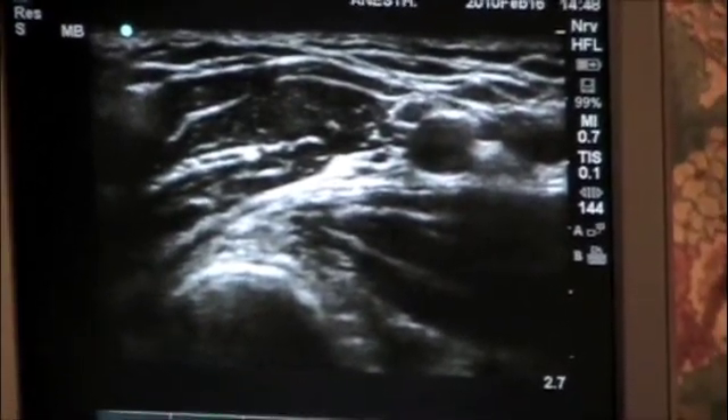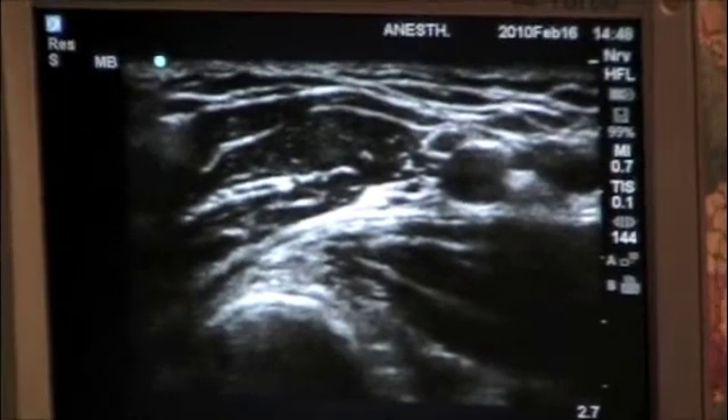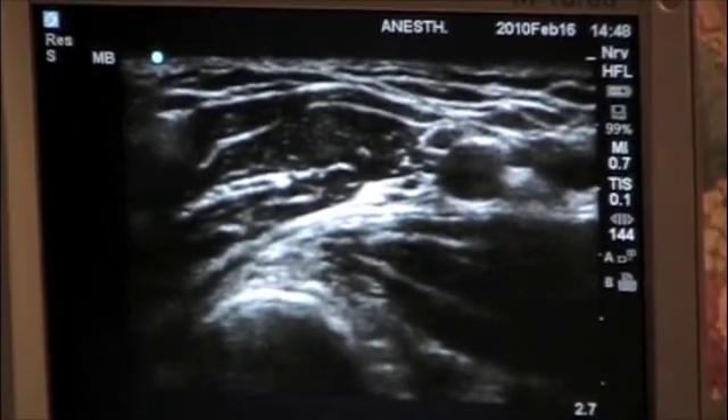This is a block you may want to combine with nerve stimulation to identify all the branches for a successful block.